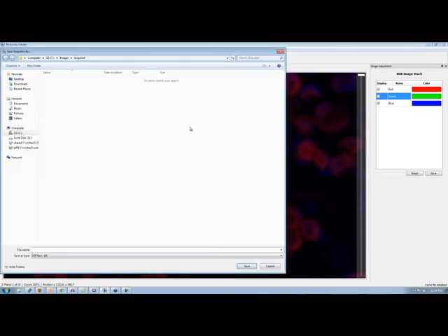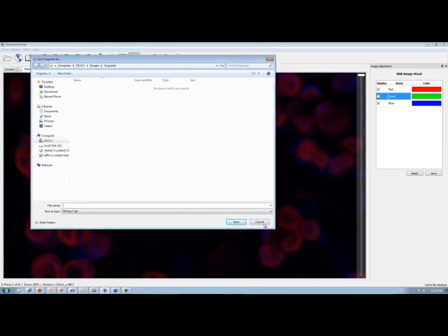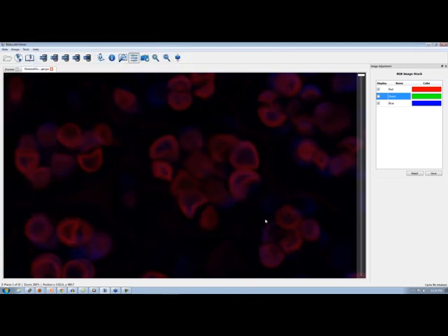And you just click on the camera icon. And you get a save dialog where you just need to enter in your file name, choose the type of file you want to save it as, and you can save that snapshot. Very cool. Jeff, something just came to mind.